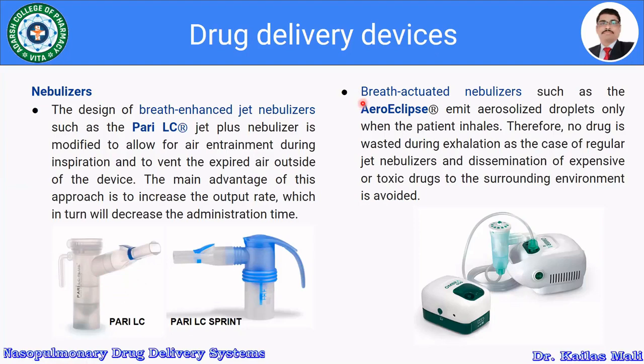Another example of the breath actuated nebulizers is the Aero Eclipse. So this is the Aero Eclipse. It is going to emit aerosolized droplets only when the patient inhales. So during inhalation only, this device is going to aerosolize the droplets.